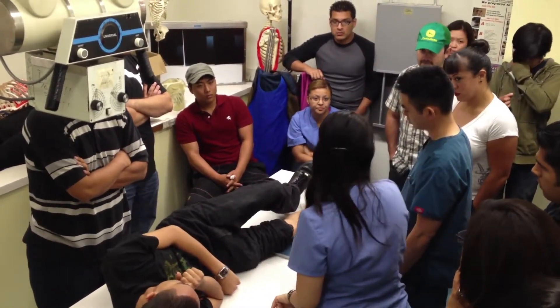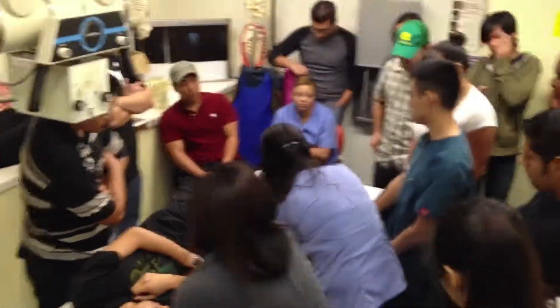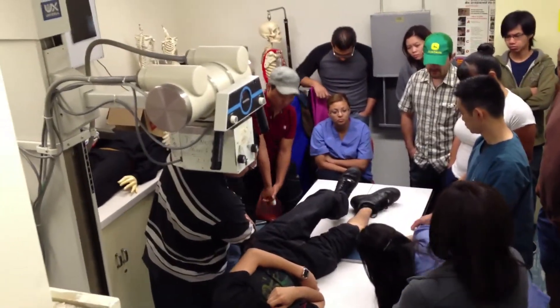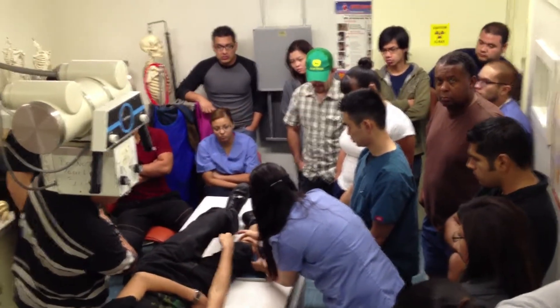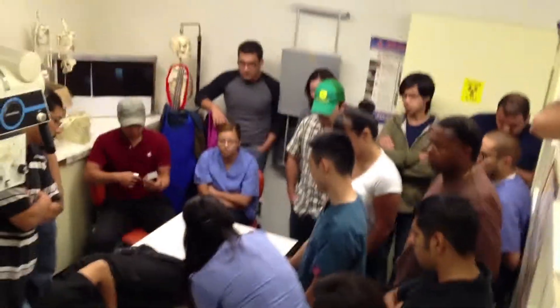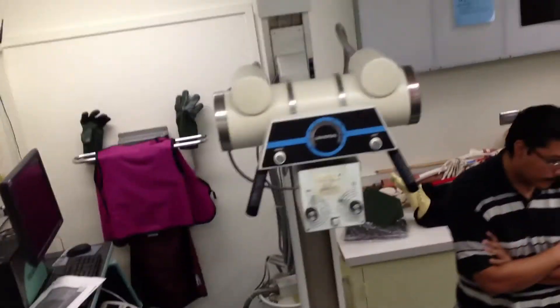Medial oblique — under-rotated and over-rotated. This is under-rotated — it looks like it's lateral but it's technically under-rotated because this part isn't down enough. This is what shows the adductor tubercle, and this is also going to show your fibula being superimposed in here. If you're over-rotated, your fibula head starts to come in profile again and it's separating. This is how you know whether it's under or over-rotated when you're checking the image.